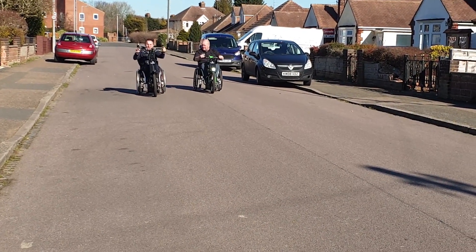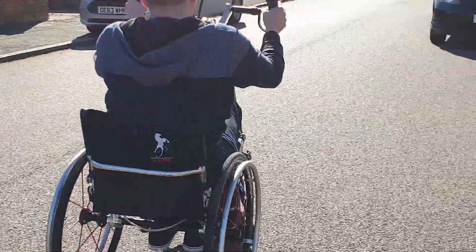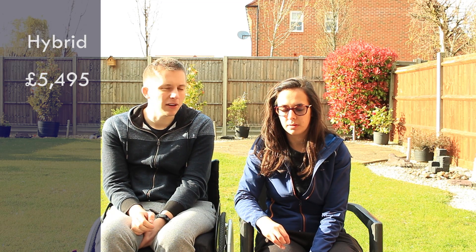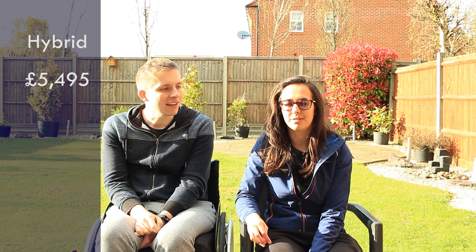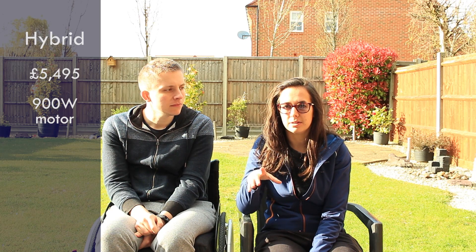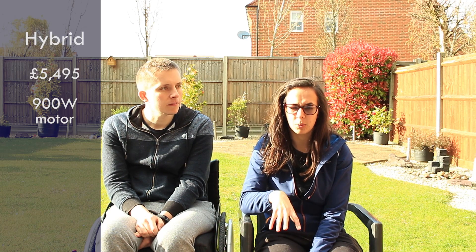Another good thing is it's got weights at the bottom by the wheel on the front, which keeps the weight down and stops wheel spin. A lot of attachments like that lose grip particularly on a hill because there's not enough weight over the front wheel, so this comes with extra weights for that. It also has a bag attachment you can buy — if you're ever really struggling you could put a couple of bottles of water in there for even more weight and grip. The motor is supposed to be very powerful — you're more likely to not get up a hill because of losing grip than the motor not having enough power.